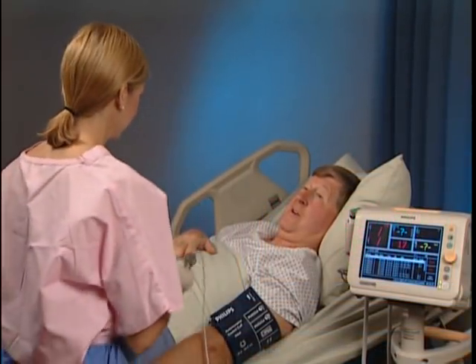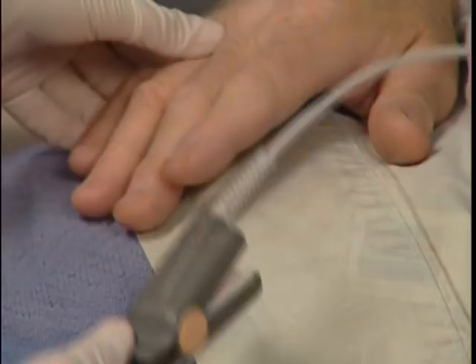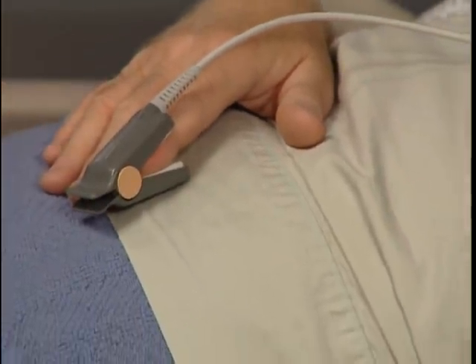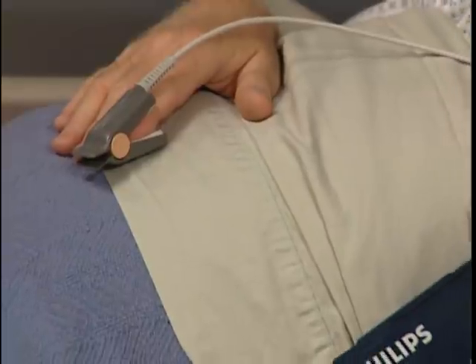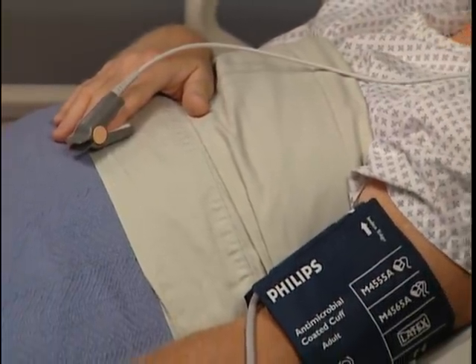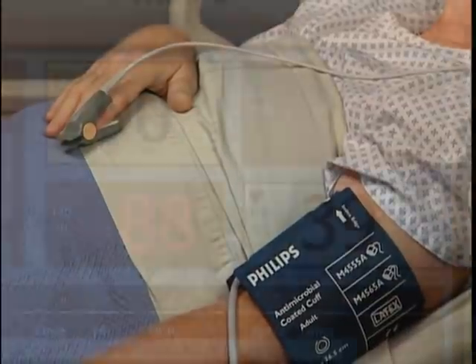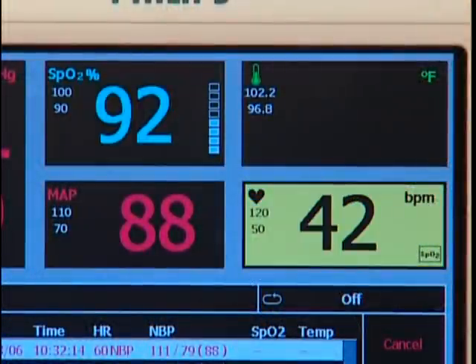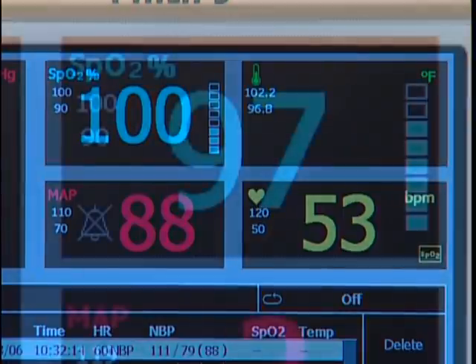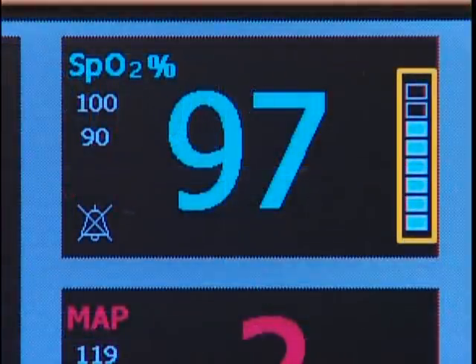When choosing a location for the SpO2 sensor, the most important consideration is to pick a site with brisk arterial perfusion. It's also important to avoid using a limb with an NBP cuff. In a few moments, oxygen saturation and heart rate numerics appear. The perfusion indicator bar is a signal quality indicator for the SpO2 measurement.